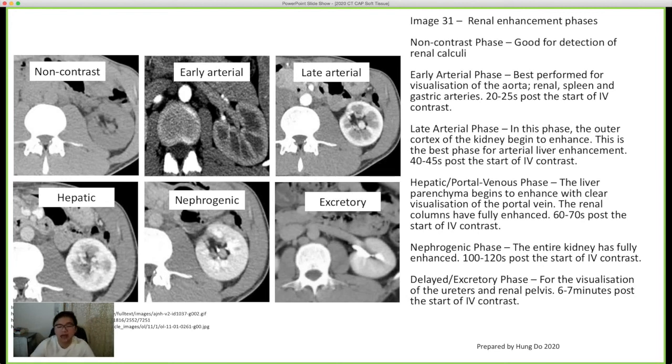So there is a rationale for a lot of these old techniques, and it's all to do with physics and just basic common sense. If you push, it's going to go somewhere, and it has to go through the weakest link. And the weakest link is either through the ureters into the urinary bladder, because going back via the vein and via the kidneys is nearly impossible. And in the gastric reflux example, it just has to go up or go further into the duodenum.